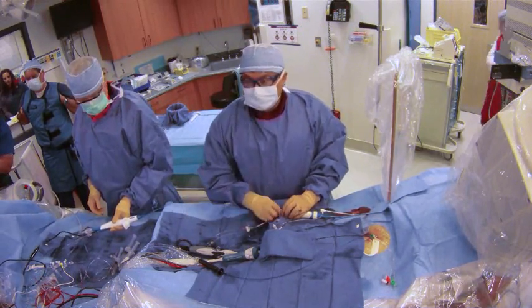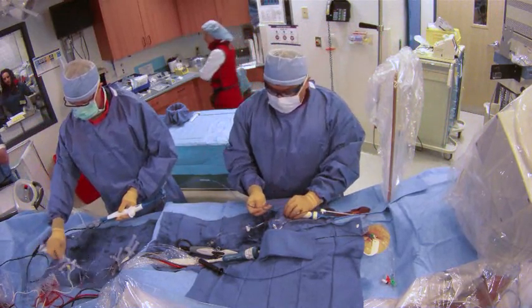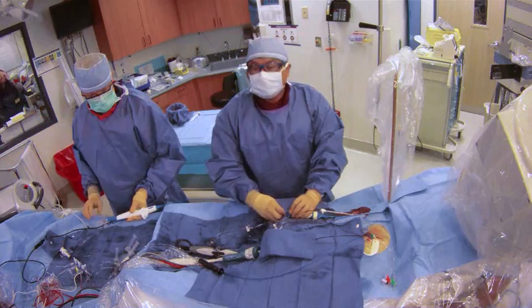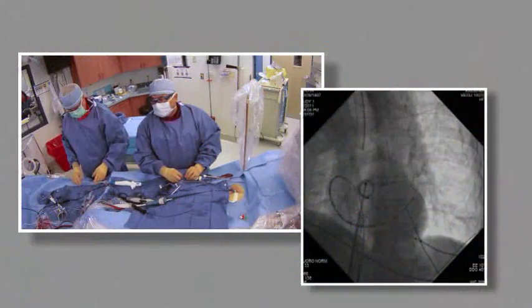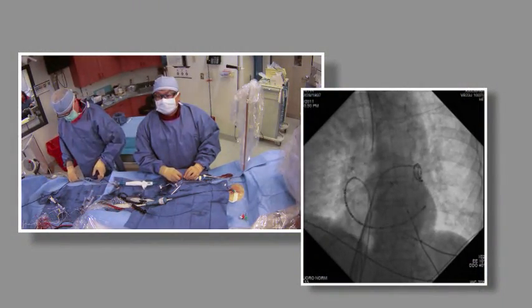At this point, when the Arctic Front balloon passes through the flex cath handle, advance the guide wire a few centimeters to make sure the wire leads the way into the left atrium. I can actually see when my balloon is going toward the atria, but I will go fluoroscopic so you can see where things are.